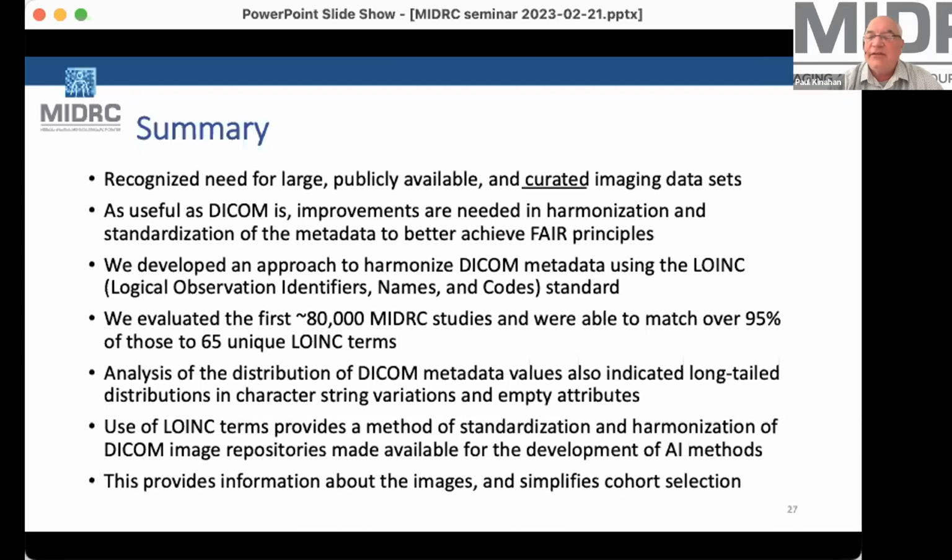So it's still on the list and it's still really important. But I think what we've done so far is help set the framework. Because to have information collected about the data quality, is it a noisy image? Is it low resolution? Are there artifacts? Those sort of things. We need to have a way to track that information.